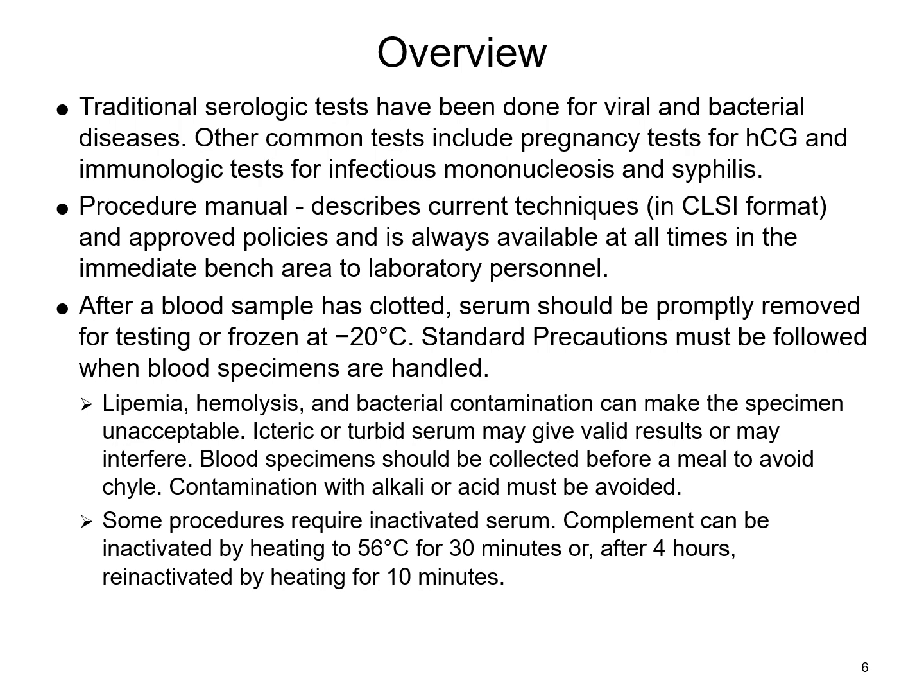After blood has been obtained for a serological procedure, it's usually collected in a plain tube without anticoagulant, although some procedures do accept an anticoagulant as part of that specimen.